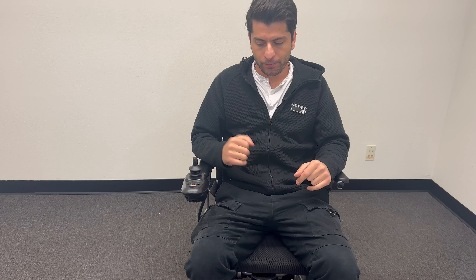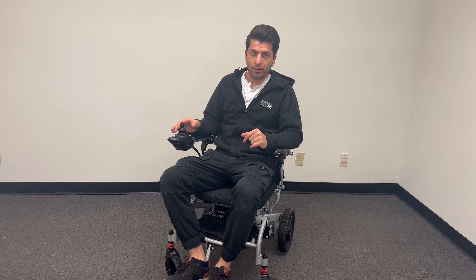Once you are ready to use, after we set up everything, you press the power button. When you hear the beep sound, you can move front or back, right or left.